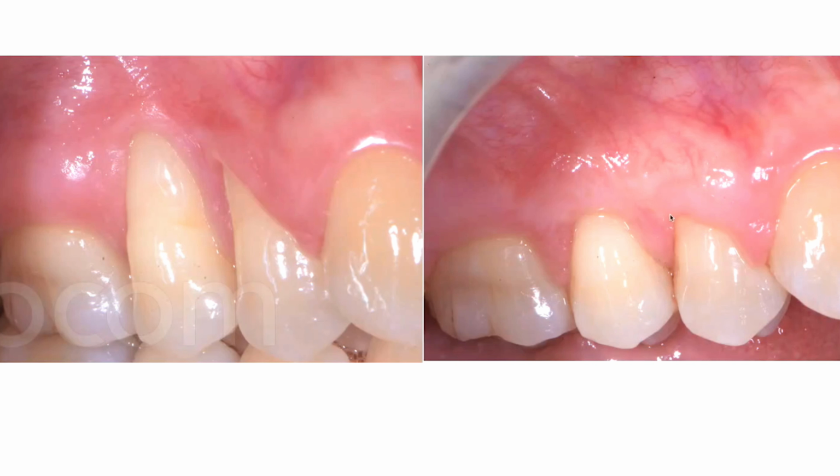Right. Yeah, the risk is that this papilla, I don't know how much it is fully attached to the root, you know, because this is a papilla that comes from the soft tissue gain due to the connective tissue graft. So in order to use this papilla like this, you have to be sure 100% that it's completely fully attached to the root.